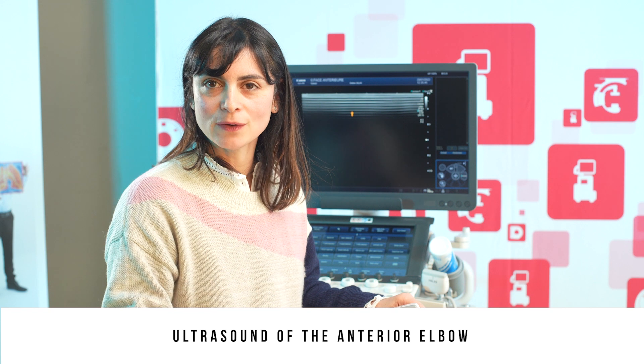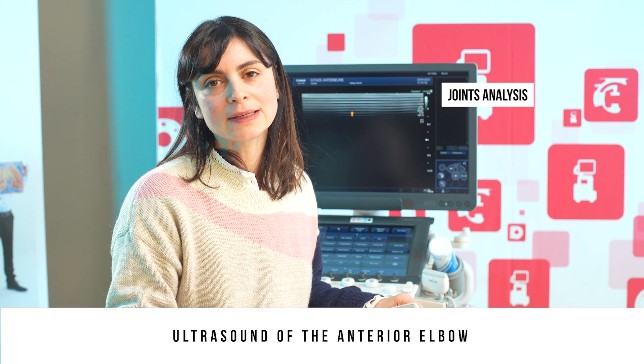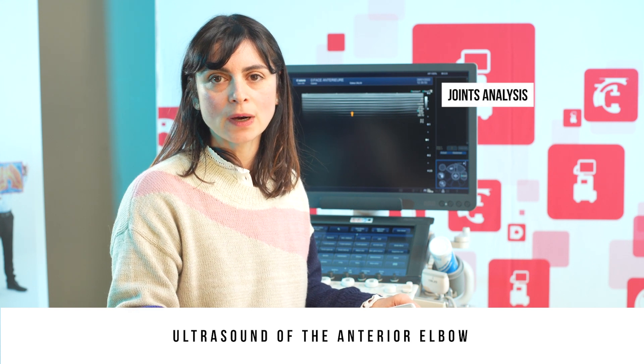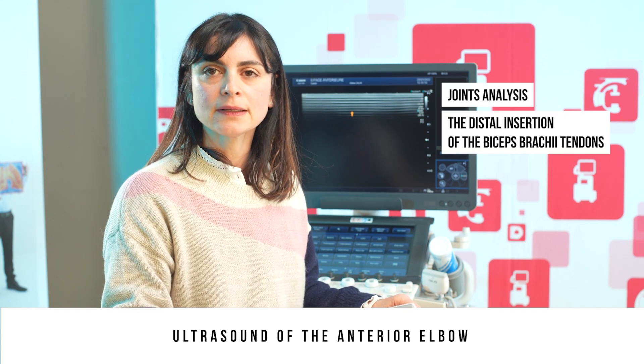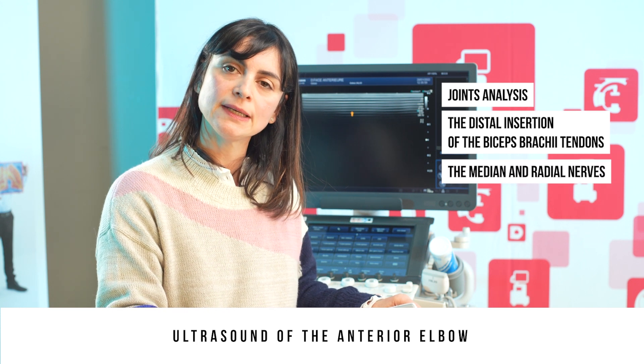To analyse the anterior aspect of the elbow, I suggest that you successively analyse the humeral radial and humeral ulnar joints, the distal insertion of the biceps brachii tendons, and then the median and radial nerves.